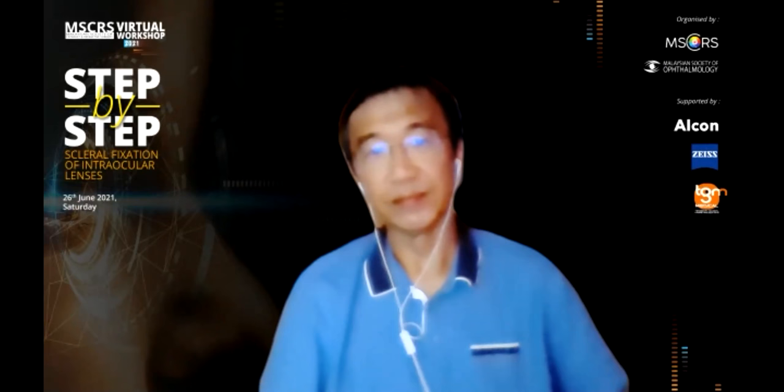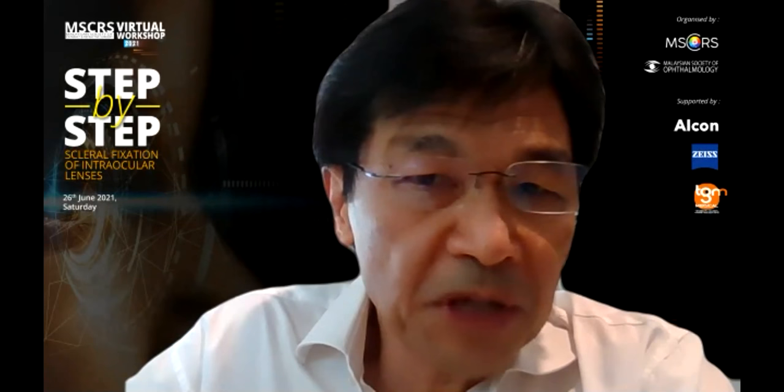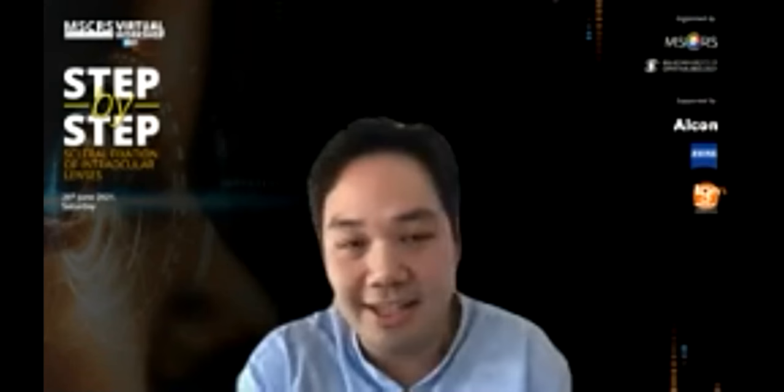Do you know where to source the punch that you mentioned just now? No, I don't think that one is commercially available yet. Kana Brava is still patenting it. I saw that Kana Brava had another video, and I think he's not advocating the punch anymore. He's designing a new lens, and he called it the shoelace. Yeah. But I think the punch is not very consistent. You can get a lot of tilt and different centration. So he's designing a shoelace lens to do that.